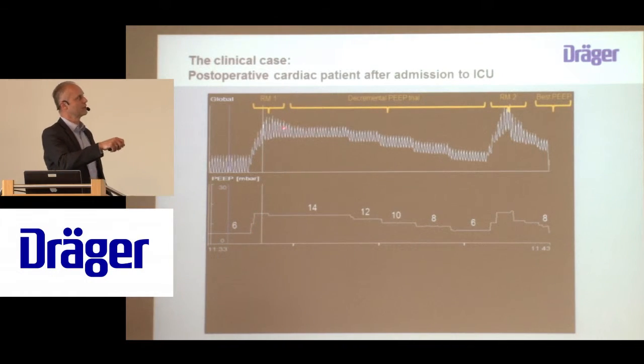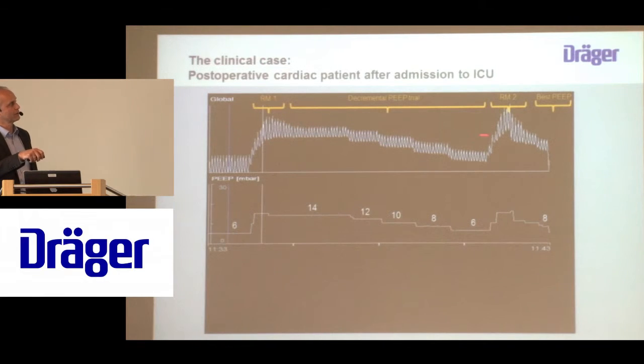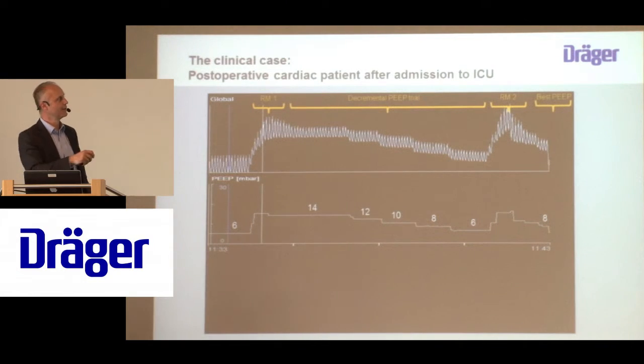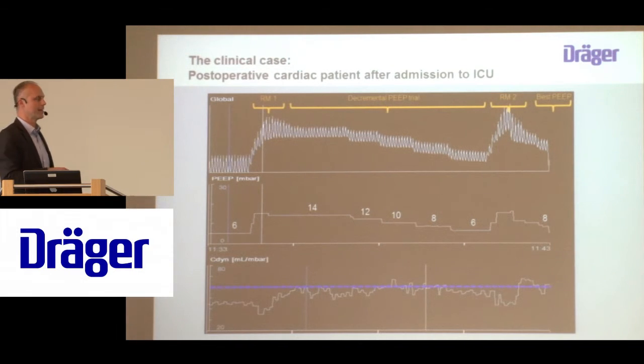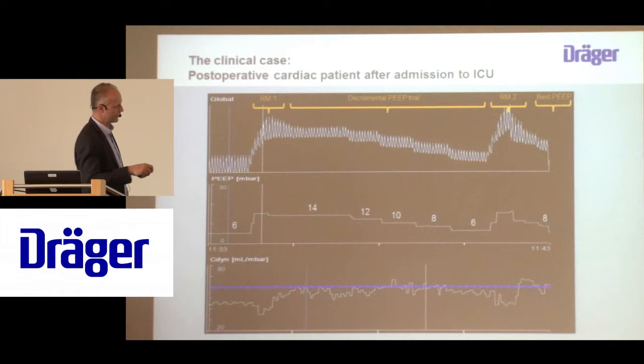But they have not used EIT to optimize the PEEP. We don't know if optimization is the right term anyway, but they have not used the EIT to set the PEEP. They have rather used the dynamic compliance from the ventilator for that.